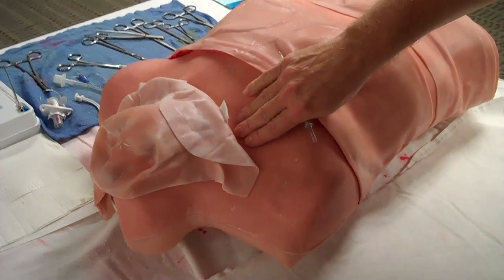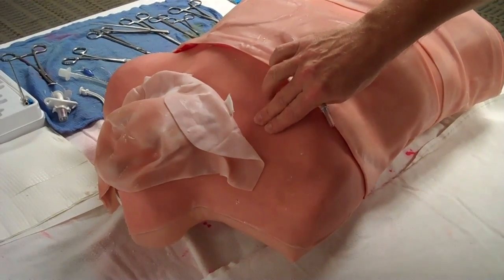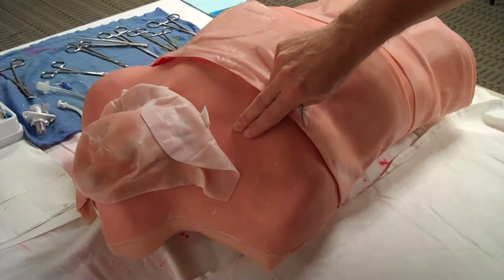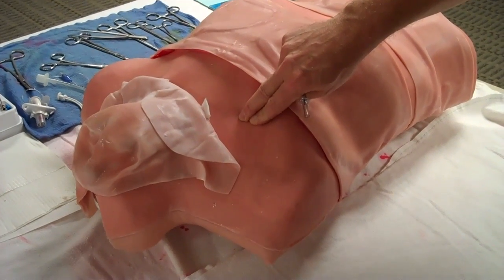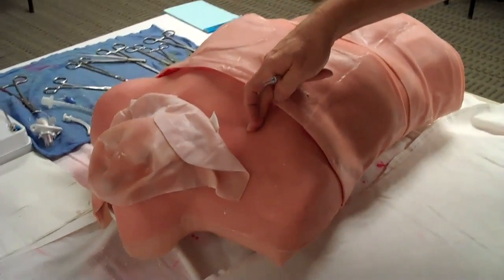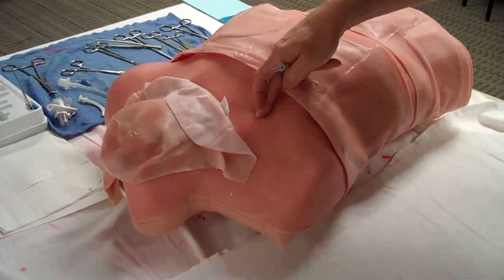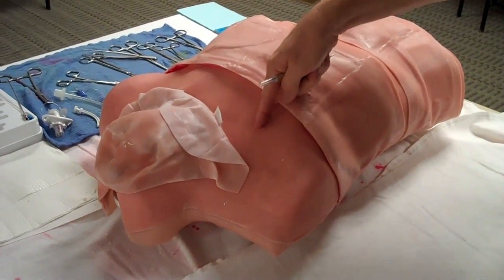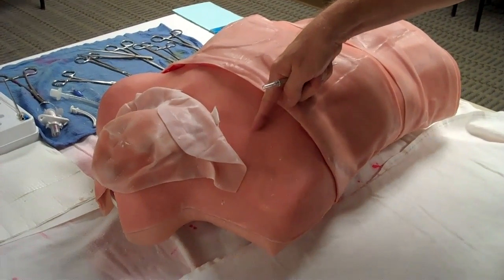Use your fingers to feel for the clavicle, then move down. You'll feel the second rib right below that. The soft spot right below that second rib will be the second intercostal space. You will want to insert in the mid-clavicular line, which also tends to be where the nipple is. So it will be right here, oriented with the nipple.